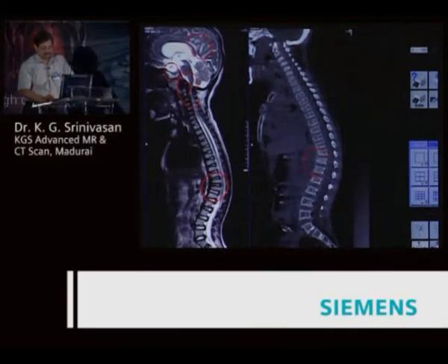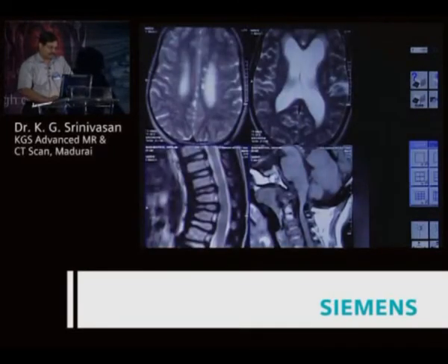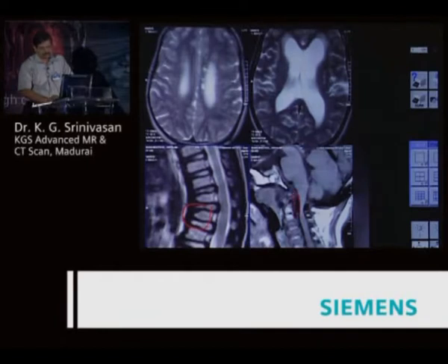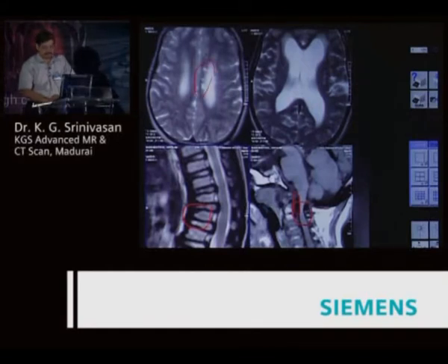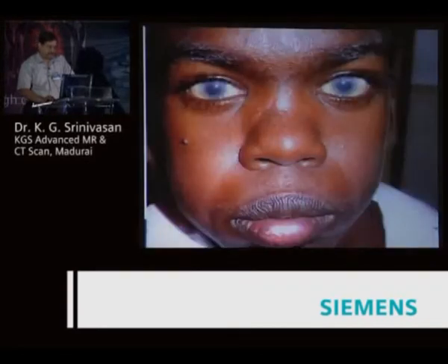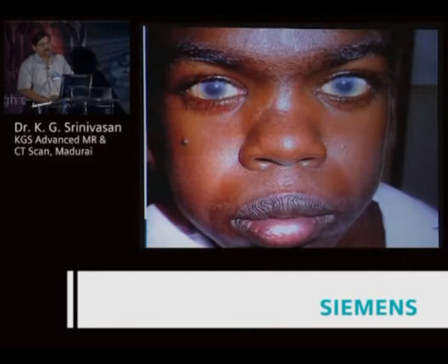This is classical mucopolysaccharidosis — there are several types. This is the Hurler type, where you can see the J-shaped appearance. Because of alpha-L-iduronidase deficiency, mucopolysaccharides are deposited over the membrane, producing significant thickening and compressive myelopathy. The dilated VR spaces are filled with mucopolysaccharides — very classical of Hurler type.